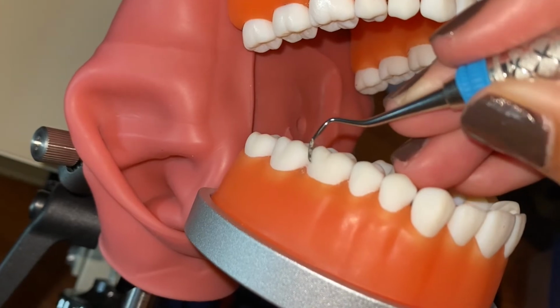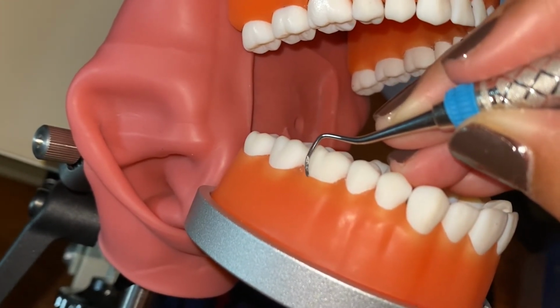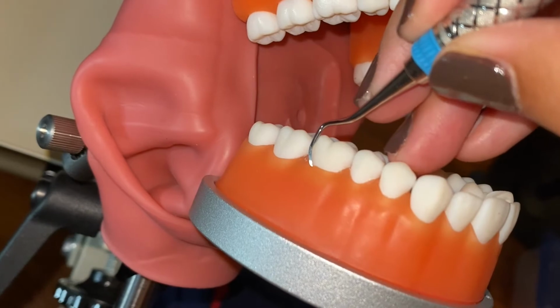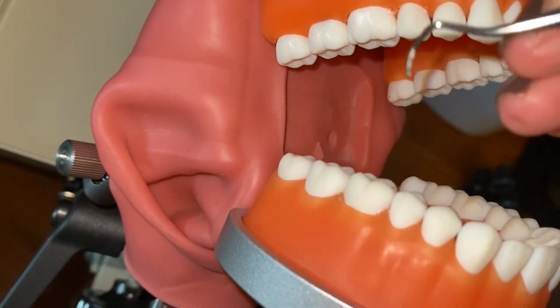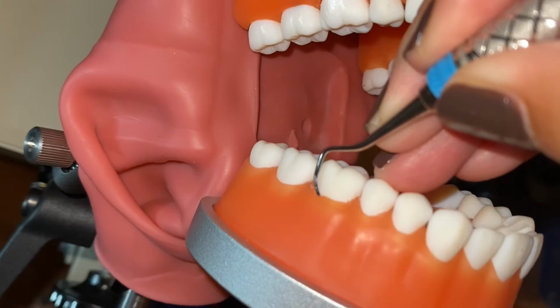Turning your instrument around, and then we're going to make sure at 0 degrees again, insert at that distal buccal line angle, opening up the instrument, making sure that corner is adapted. There.